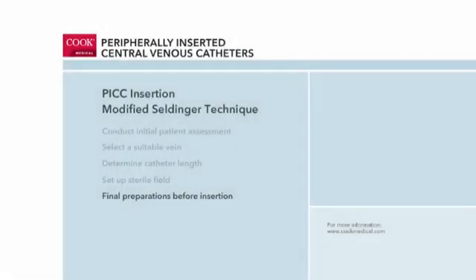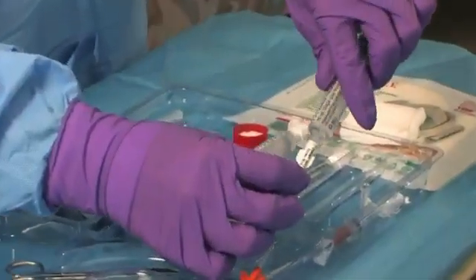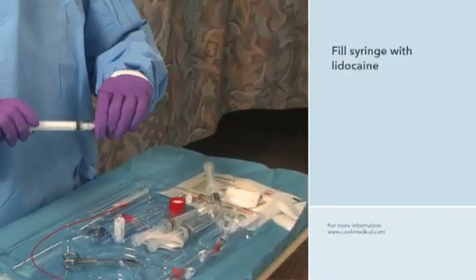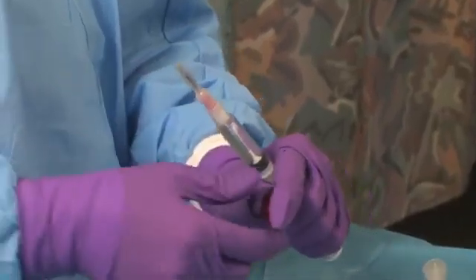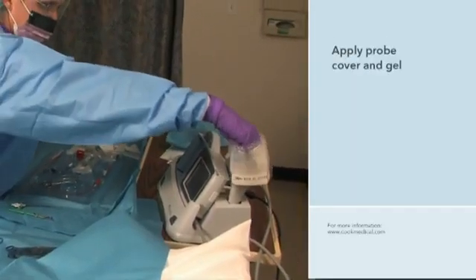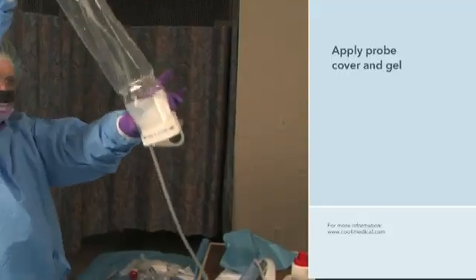Final preparations are made for the PICC insertion. The clinician removes the air from the saline syringes and flushes both lumens of the catheter, then clamps them. She opens the lidocaine ampoule by snapping off the top, attaches the filter straw to the syringe, and draws the lidocaine into the syringe before attaching the needle. She places all necessary items within easy reach, then places the sterile probe cover on the ultrasound probe over the previously applied gel, secures the cover with rubber bands, and applies sterile ultrasound gel to the probe cover tip.